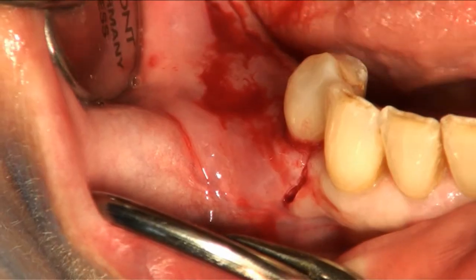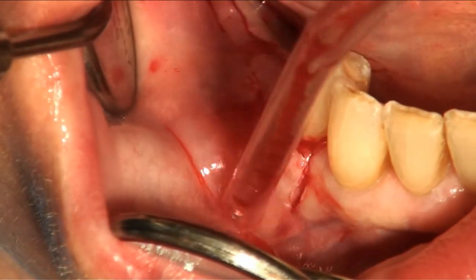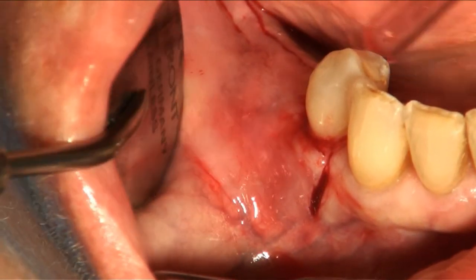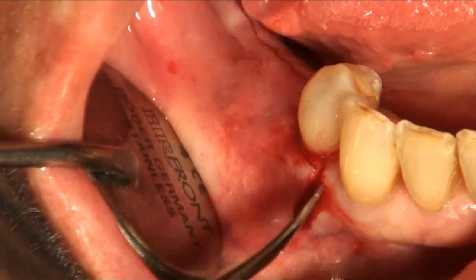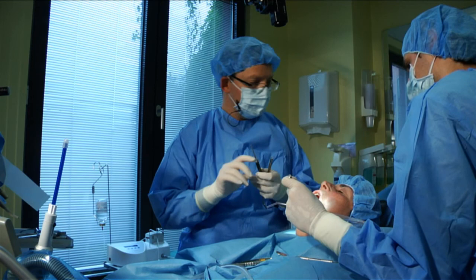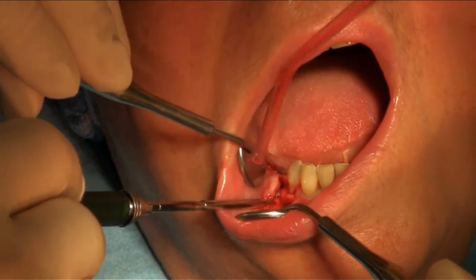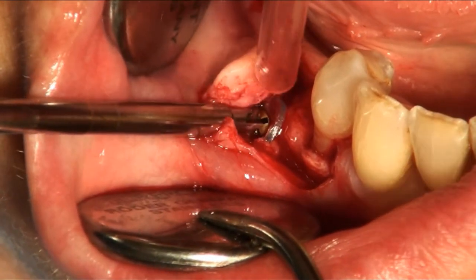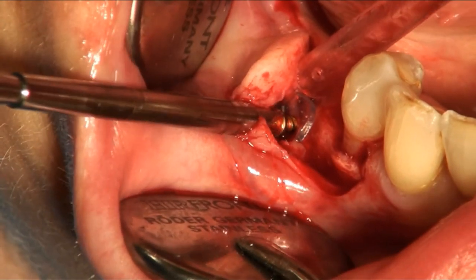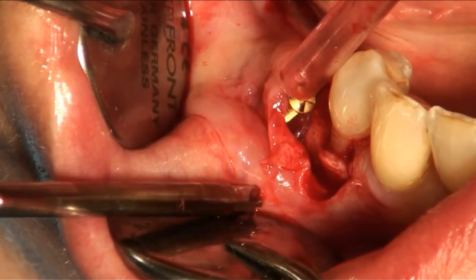So the incision is performed, and now we will reflect the flap, opening up the site, and we will find our expander in place. So here my screwdriver comes along, and you see now the screw is removed.